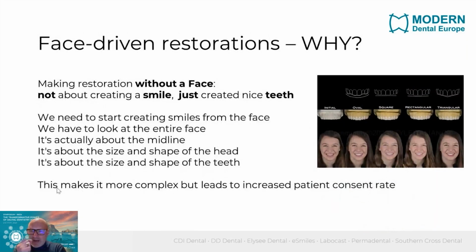So why is this so important, these face-driven restorations? Well, it always starts from the face. We are not creating nice teeth only, we are creating a new smile for full rehabilitation cases, for instance an all-on-X case, or a denture, also just a removable denture. This should always start by creating a smile from the face.